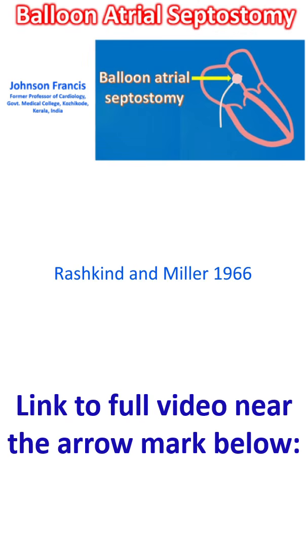The balloon at the tip of the catheter is inflated and abruptly pulled back into the right atrium, tearing the interatrial septum.